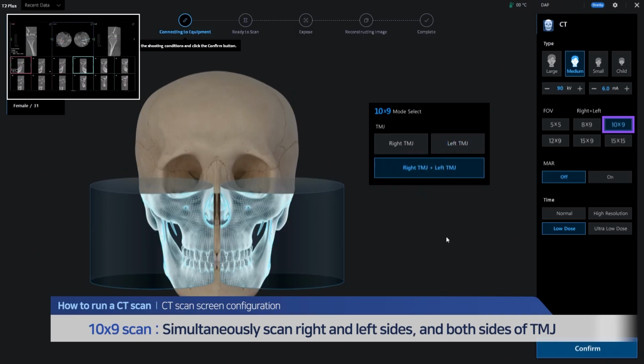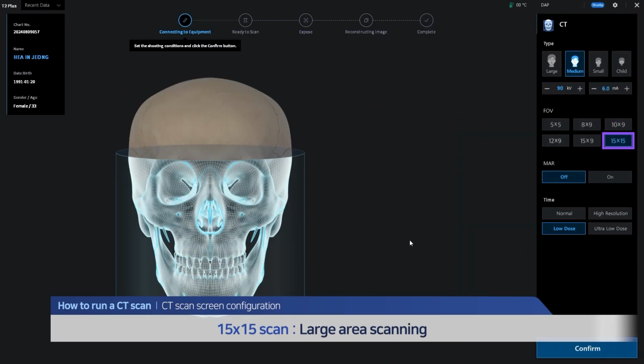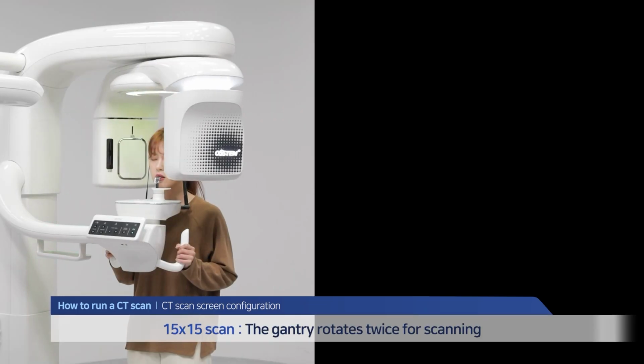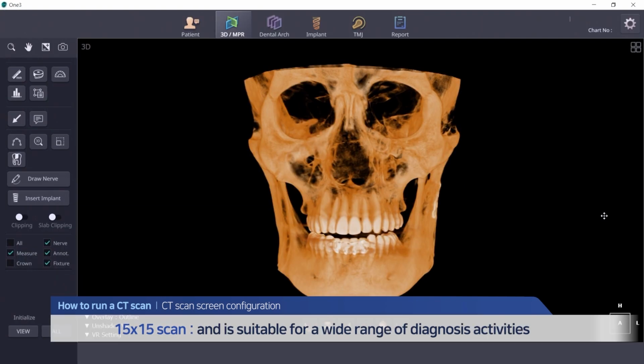For a both side TMJ scan, you can do a 2-rotation scan to match the right and left sides for comparative diagnosis. You can use 15x15 scan for larger areas. The gantry rotates twice to scan from the lower jaw to the orbit, which is useful for a wide range of diagnosis activities.